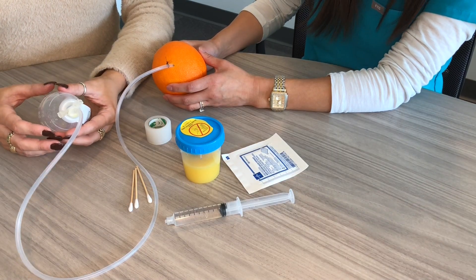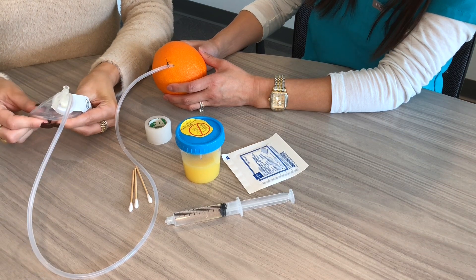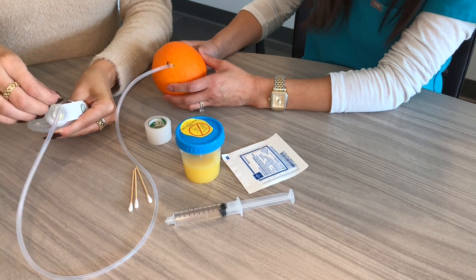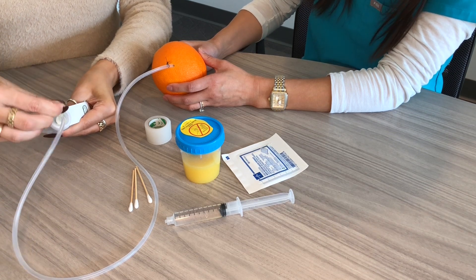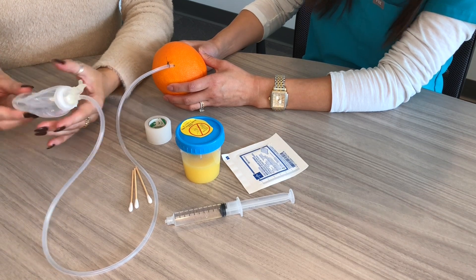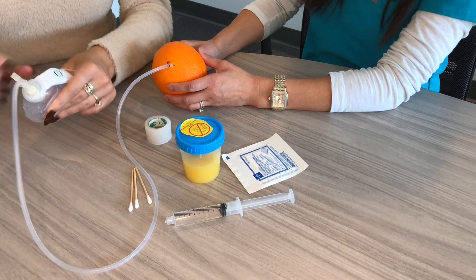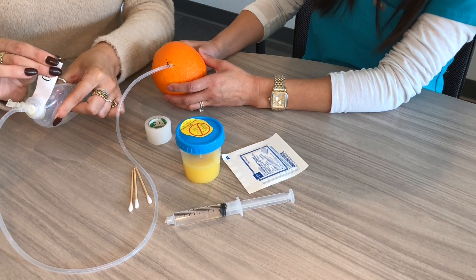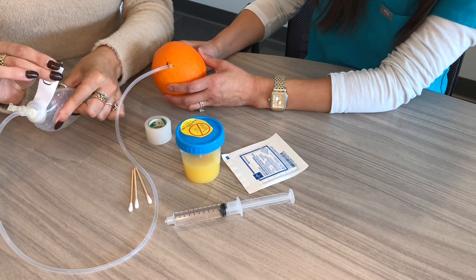Now to finish up, squeeze the bulb while it's uncapped — you really want to compress it all the way. While squeezing, go ahead and recap the bulb, and that creates suction. Now you're going to pin the bulb back to your clothing using the plastic tag. This avoids it accidentally pulling out.